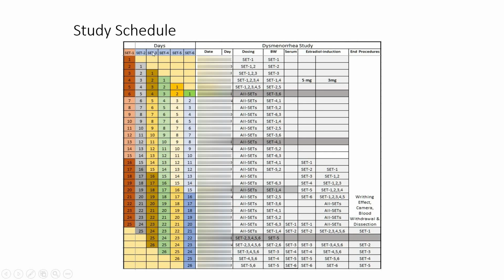Accordingly you have to work. On day 1 I took set 1, around 10 animals, and treated and dosed them. Up to day 15 it is the prophylactic dosing time, and after that, days 16 to 25 are the therapeutic dosing.